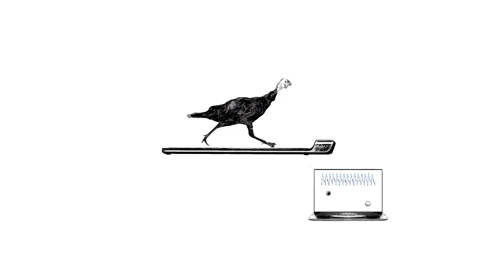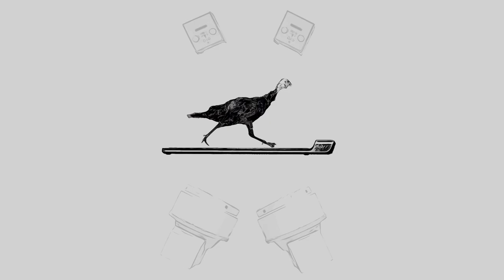In collaboration with Brown University, the researchers checked the accuracy of magnetomicrometry in untethered running turkeys, using a pair of X-ray cameras that let them precisely monitor the relative bead positions. With this setup, they showed that magnetomicrometry was able to track muscle tissue lengths with sub-millimeter accuracy.